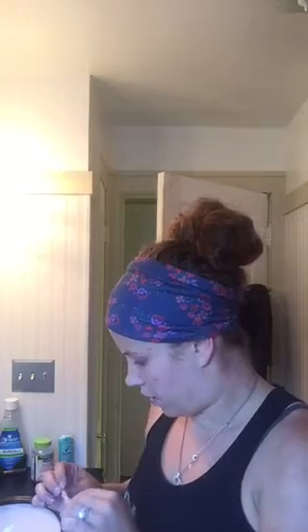Make sure I'm getting all the air bubbles out. There's a big one on the bottom there. There we go. Looks like there's some air bubbles in the solution, but push it up until it comes out the top. I don't want to do it too much. Ooh, these are kind of hard to push. Oh, there we go. There's a little bead on top. That shows that all the air is out of the needle. That took a long time, sorry. All right. I'm going to cover that real quick.